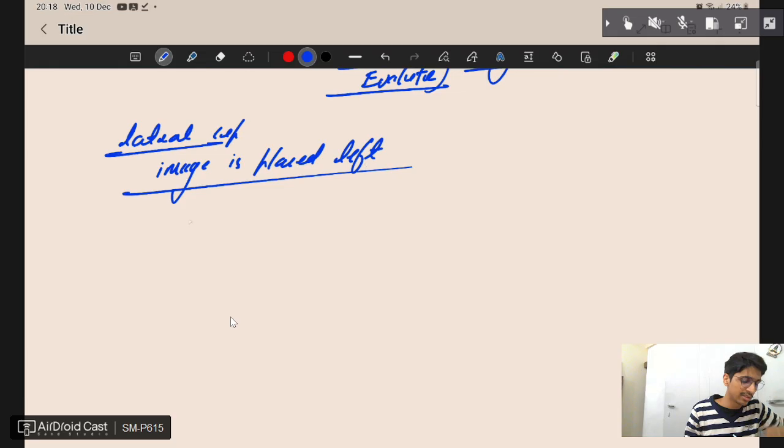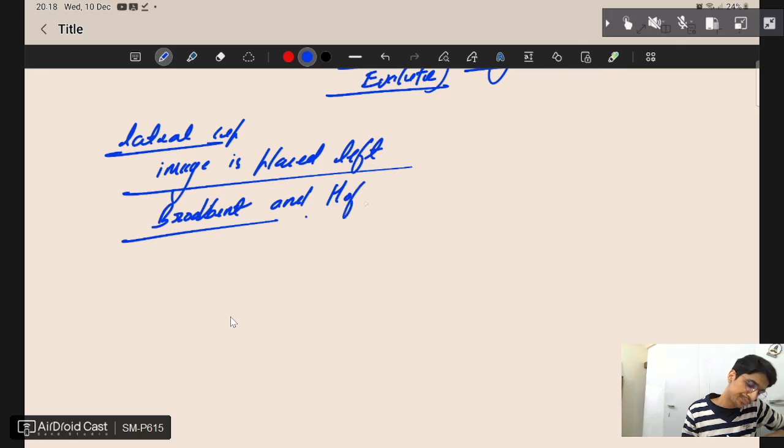This was introduced by Broadbent and Hofrath in 1931. Sometimes they ask this in INI.